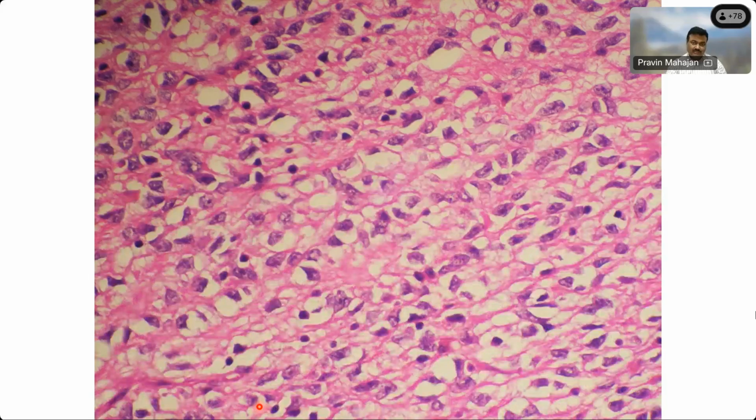You do the appropriate markers. See the sprinkling of lymphocytes. And I still remember Madam Borges, Dr. Borges, used to say that this tumor usually has only sprinkled lymphocytes, they never have plasma cells, which is a very nice clue. Afterwards, when I saw a few of these cases, although these are rare, they usually have only lymphocytes and no plasma cells somehow.